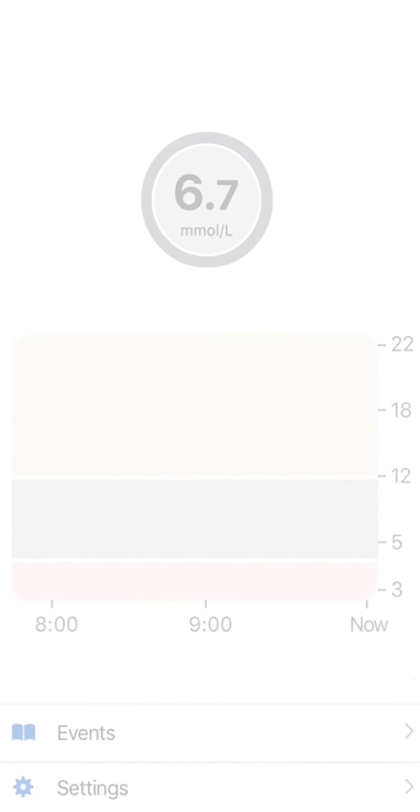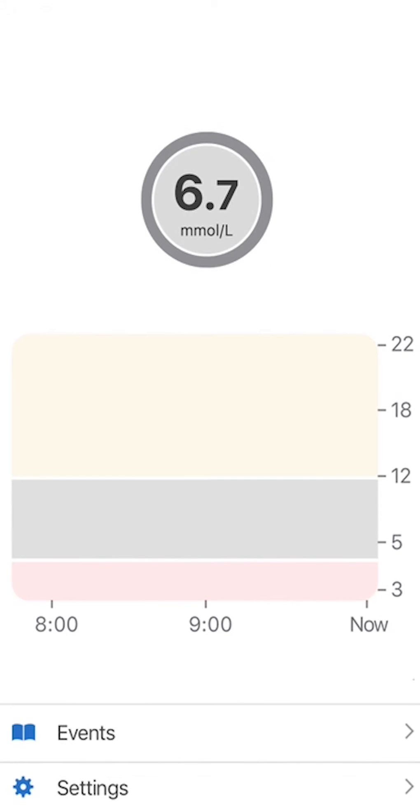Once your warm-up is done, you will get your G6 sensor glucose readings or G6 readings, glucose trends and your alarms and alerts.